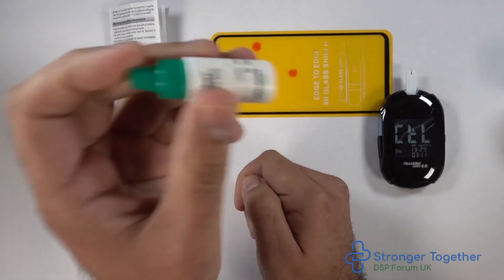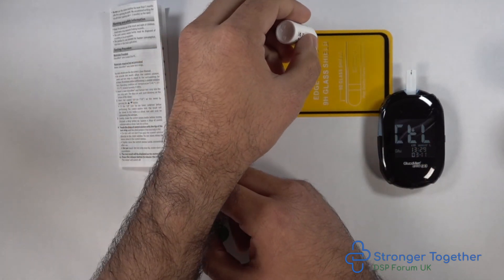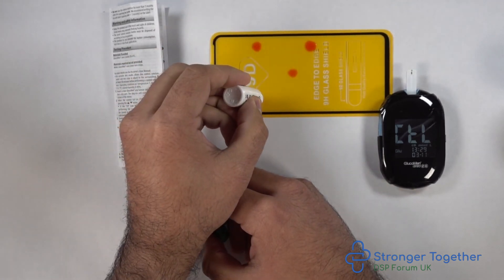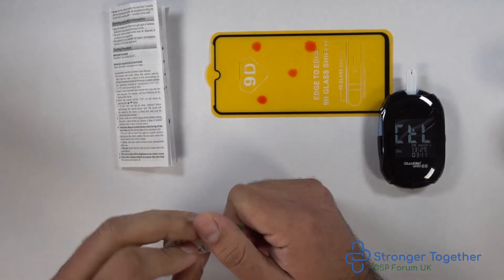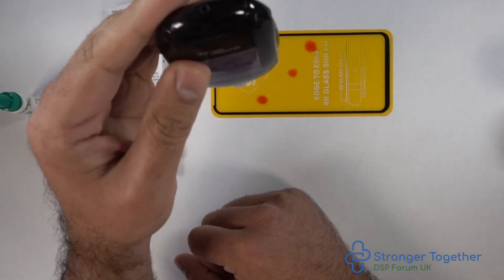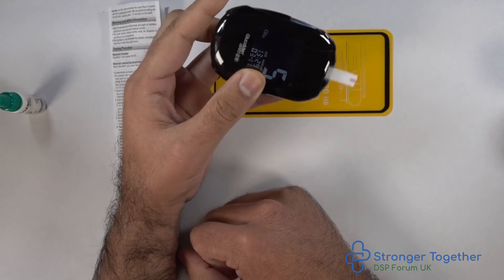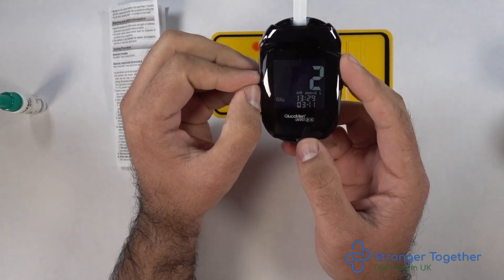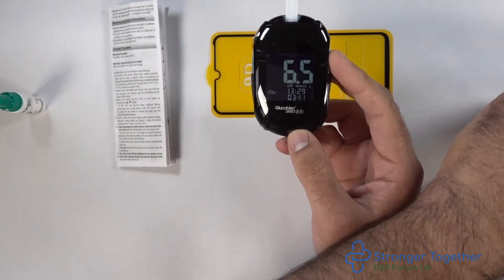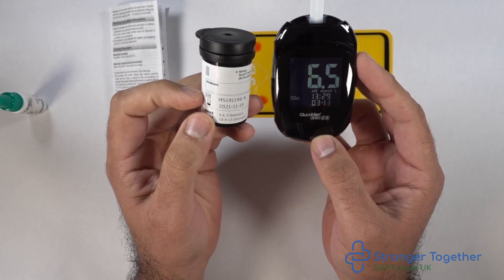Shake the bottle and discharge a drop onto the surface — I will discharge two drops and use the second. Touch the test strip onto the solution. Again we have a countdown from five down to one. Our reading is 6.5, and if we look on the side of our pot, this reading is between 5.6 and 7, meaning our meter and strips are working correctly.